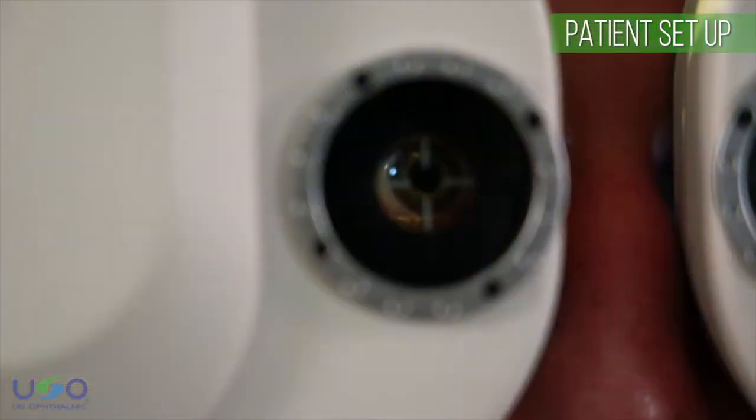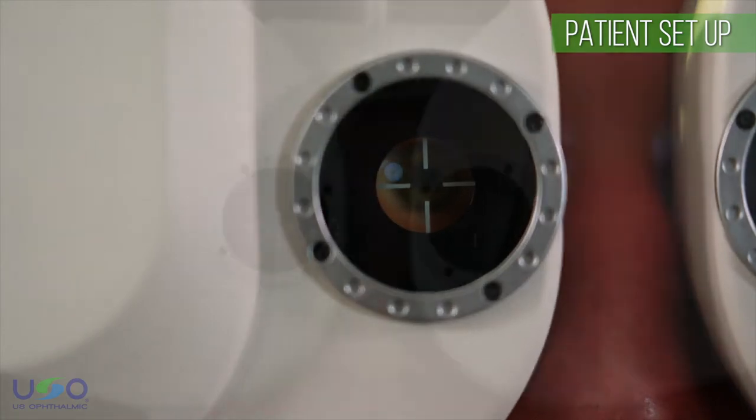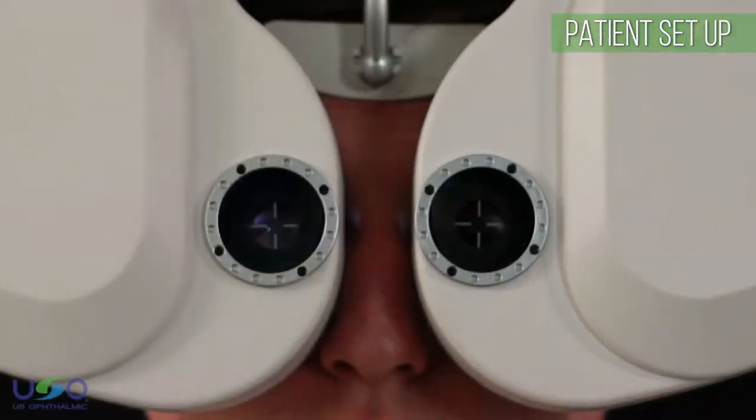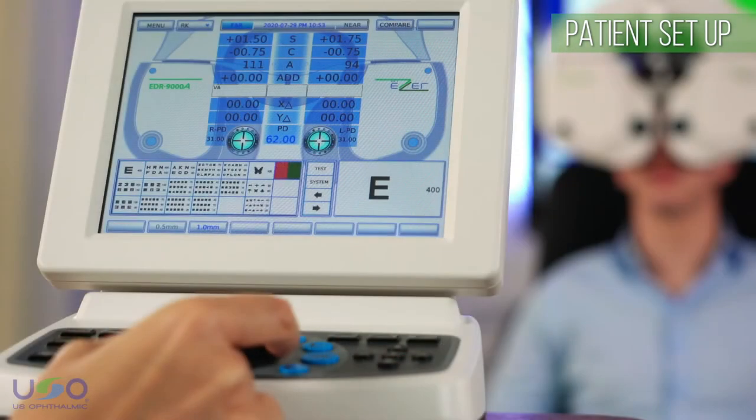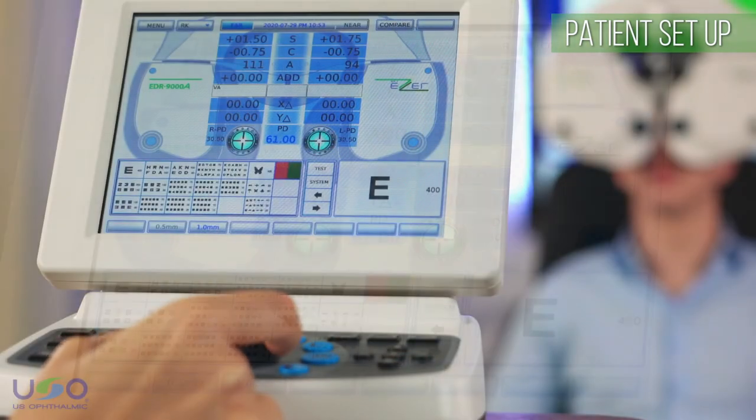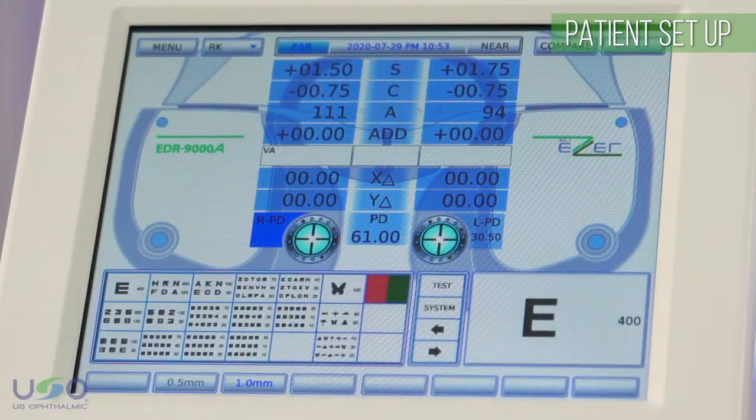Through the digital refractor's convenient alignment lens, the practitioner can make manual adjustments to the inner pupillary distance in order to center the patient's pupils with the device. These adjustments can be made for both eyes simultaneously or for either eye individually.